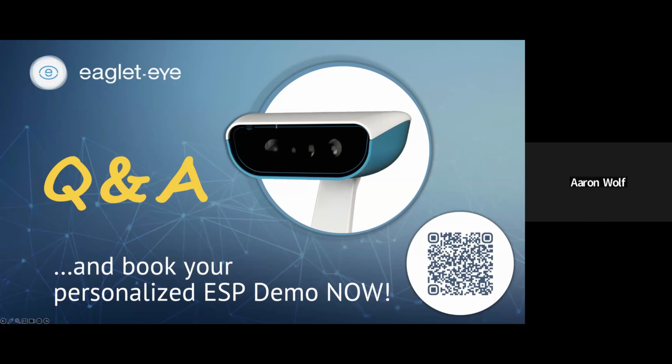And some of these patients just have really poor vision, as I think we all know. They're doing their best to focus on the target, but sometimes they're just seeing a massive red blob or something in their view. So it's a little bit more forgiving, I guess, in that way. Obviously you're going to get a wider scan. That's a really huge component.